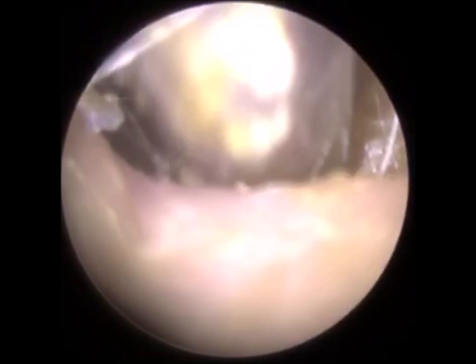You can see them really tugging away there at the dead skin plug. I think I'm going to be going in a moment with some forceps just to see if I can get a grip and retract this and extract it from the ear, but it's still very tough in there.